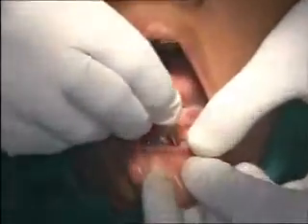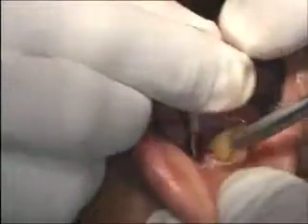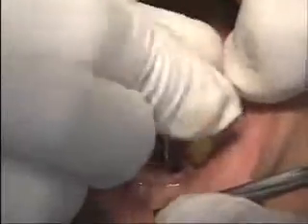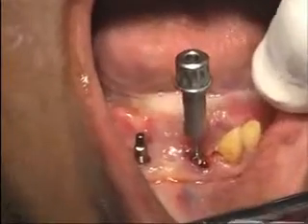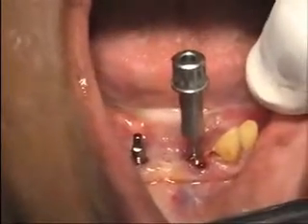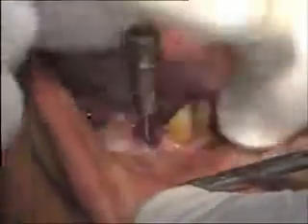This lady will have a fixed prosthesis tomorrow. Second — one more implant please. Thread designs only in the apical area. These are the type of implants that you will put easily in your clinic. If you go one day to your clinic and find a patient who has got lower anterior moving, take out the tooth and put this — you will be so glad that this is not going to fail. The protocol is easy, patient is easy, comfortable.